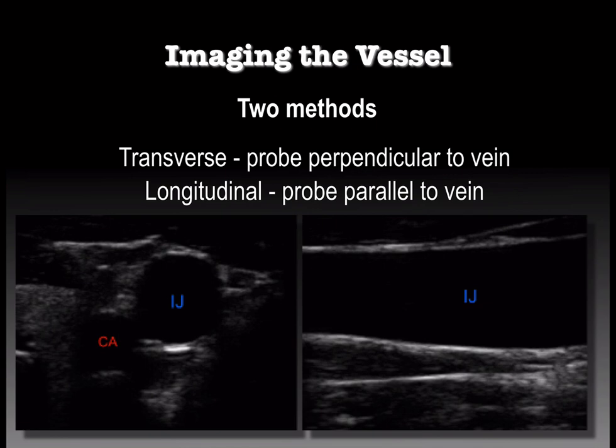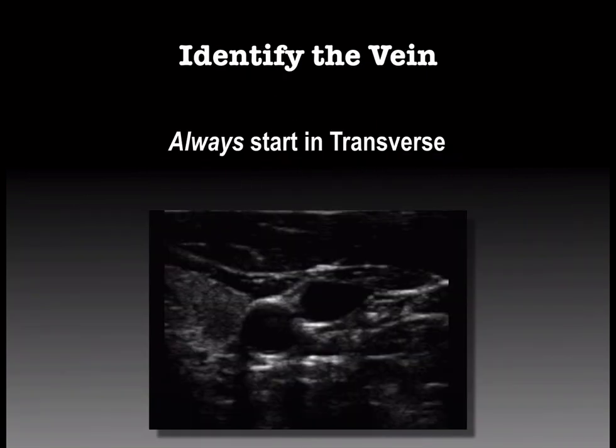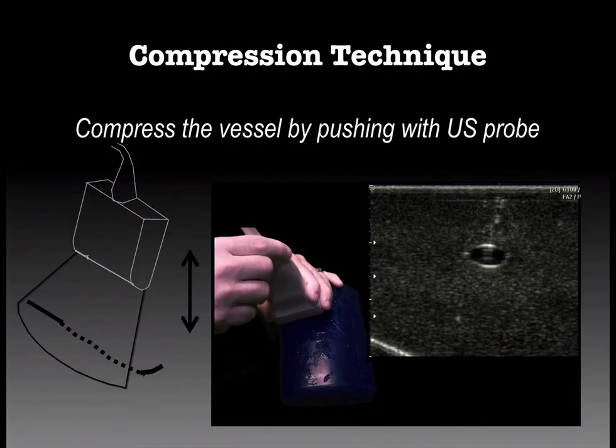So if you're talking about the IJ, you have the IJ vein and the carotid artery running parallel. So you have two pipes running under the skin. When we take our probe and come across it, the pipe looks like a circle. When we're parallel, it looks like two parallel lines, the anterior and posterior walls of the vein. Now, no matter how we end up looking at the vessel, we always start in cross-section, where it looks like a circle. And the reason is because we can push down with our transducers.